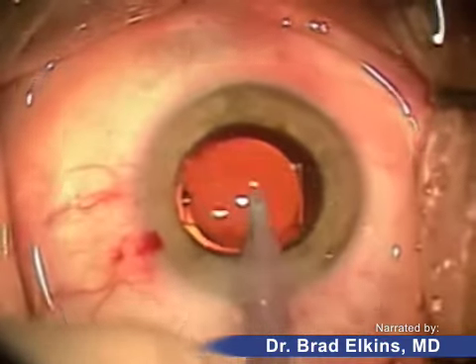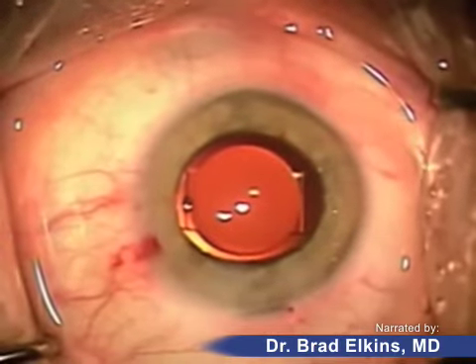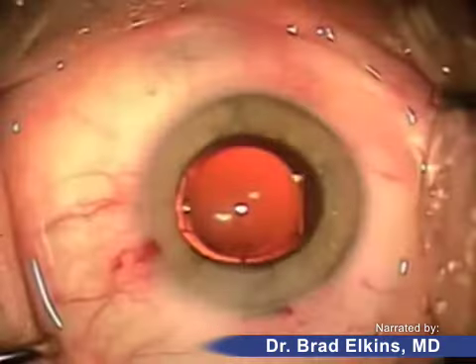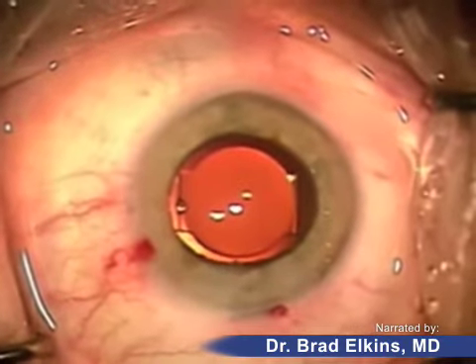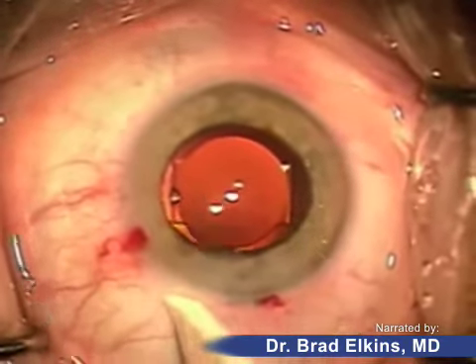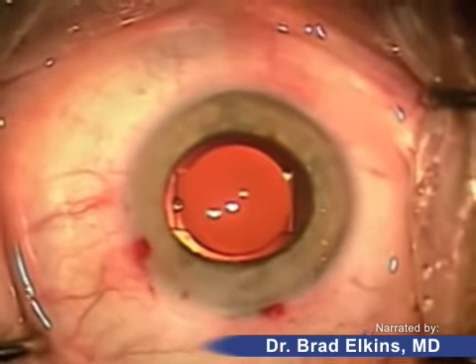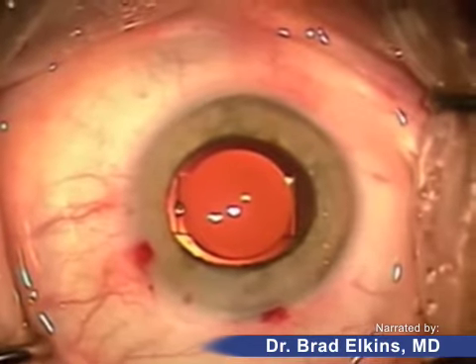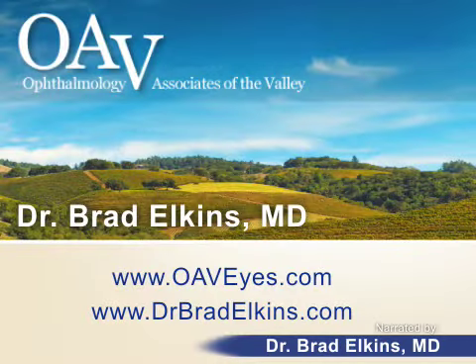This is also a check to make sure the lens is staying in a backward position — we don't want the lens to come forward. I'm checking the eye to make sure it's watertight and not going to leak. The lens is sitting posteriorly, which is the correct position during the surgery.